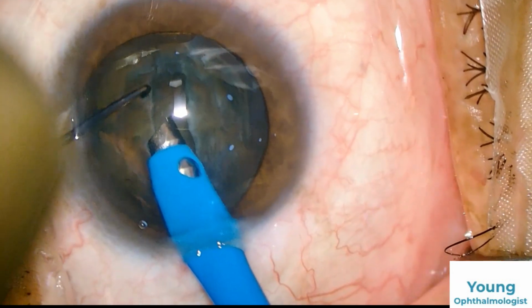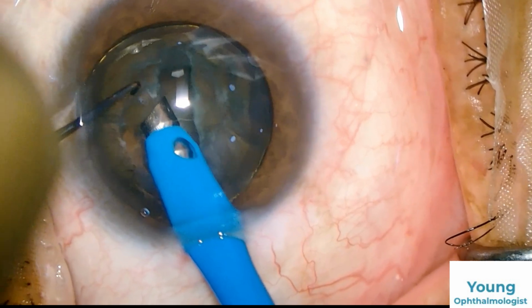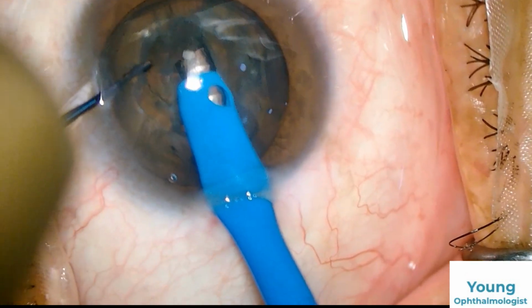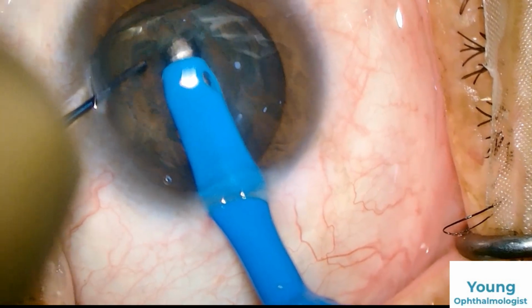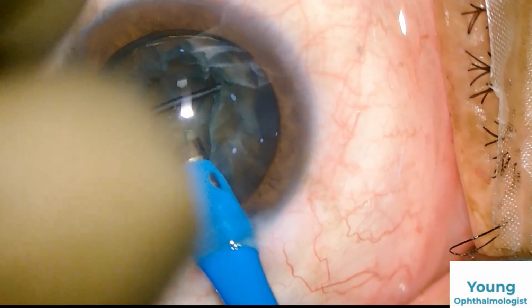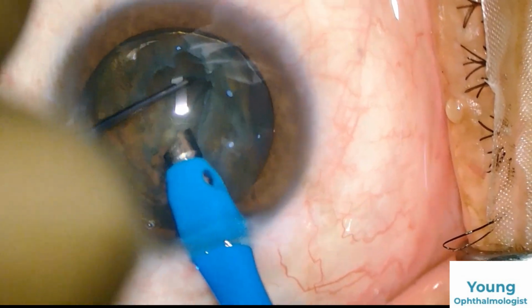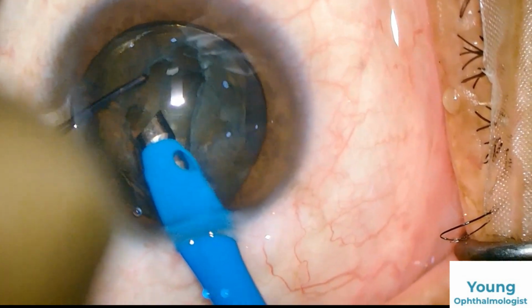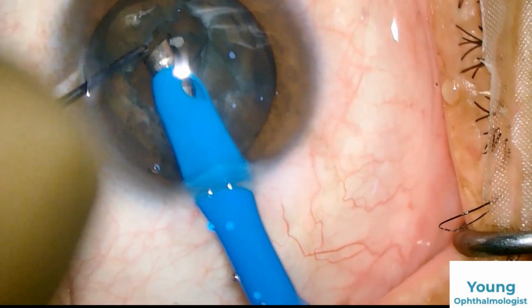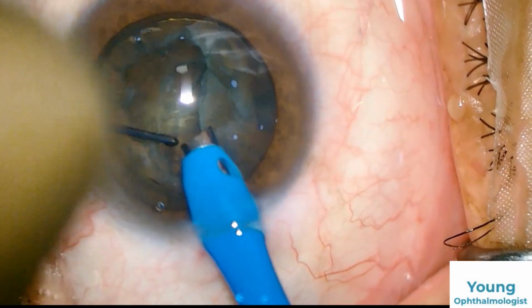In any case which is complicated, like any high myopia patient or polar cataract, the main criteria is to do low pressure, low flow phaco. The fluidics should be slow. There should be no turbulence. Same in topical phaco, you should optimize the vacuum and flow settings to prevent any fluid surge and minimize patient discomfort. Sudden pressure changes during phaco should be avoided.